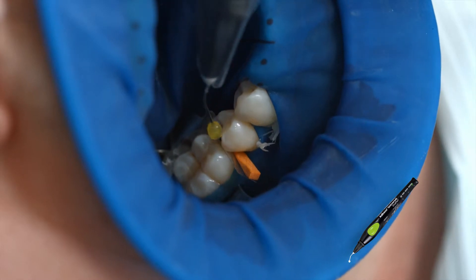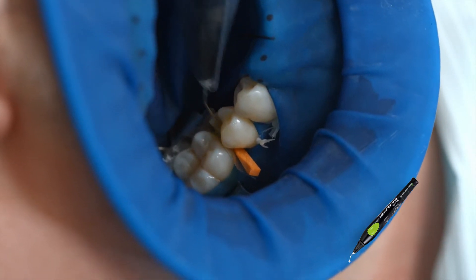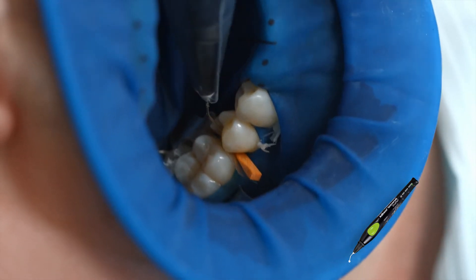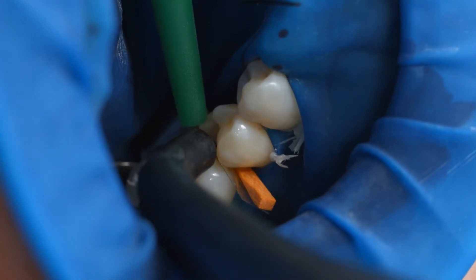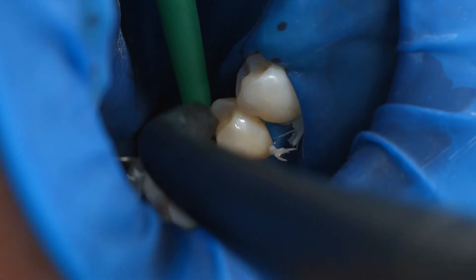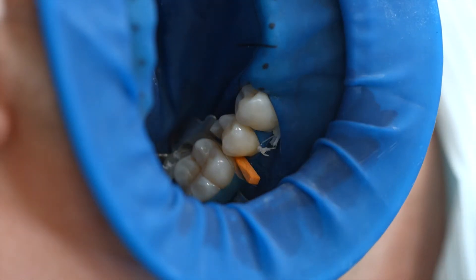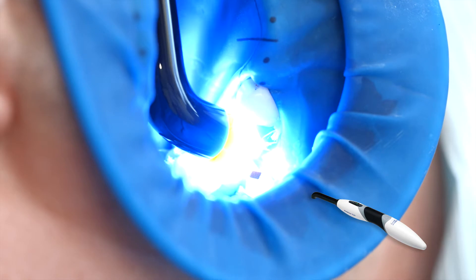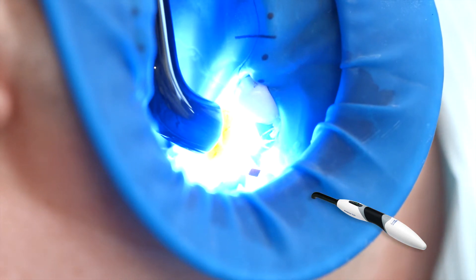Coat the entire bonding surface with Adhese Universal and scrub the adhesive in for 20 seconds, starting with the enamel surfaces. Disperse excess amounts of Adhese Universal with a stream of air until the mobile liquid film has disappeared — make sure to avoid pooling. Light cure Adhese Universal for 10 seconds using a curing light with a light intensity of at least 500 mW per square centimeter, for example blue phase style.